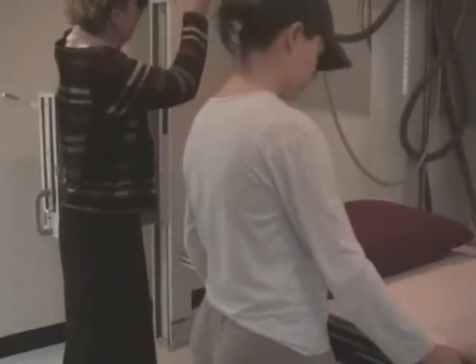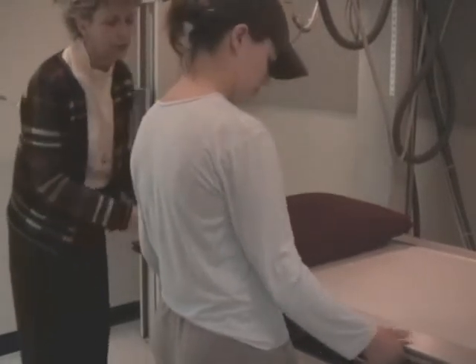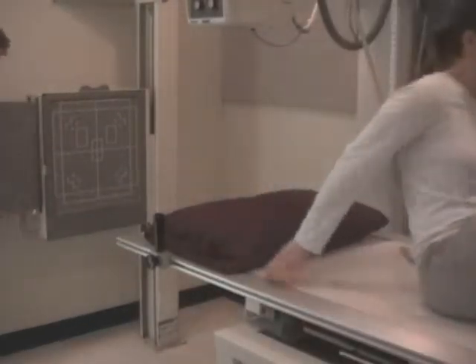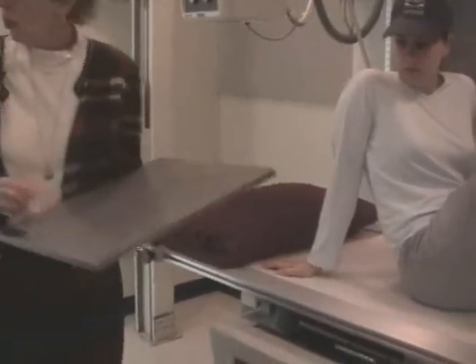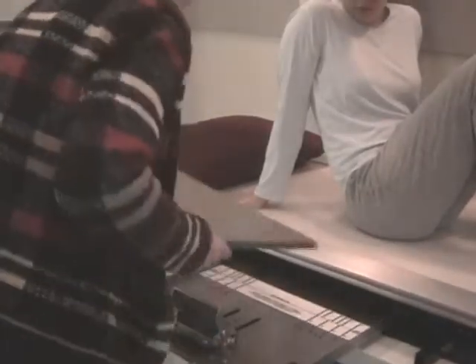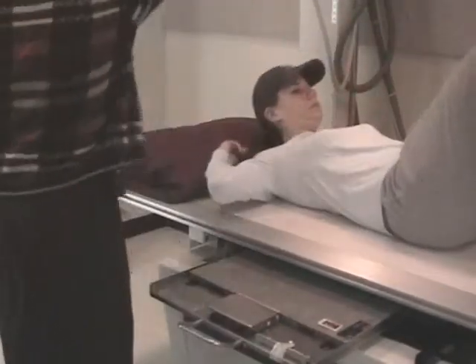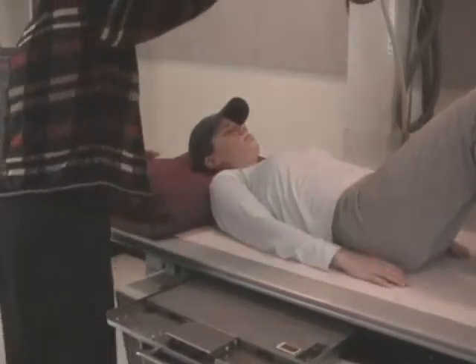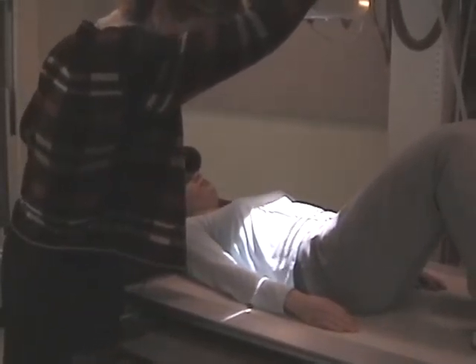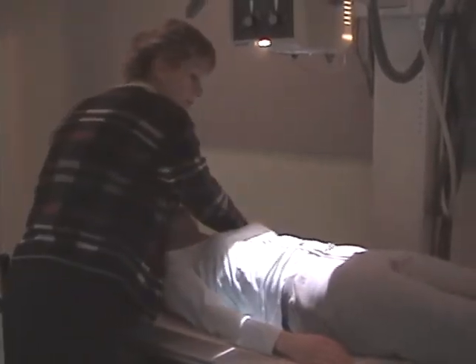You maintain the 40 inches of SID. Tube is transversely centered. You're going to utilize a 14 by 17 ID to the bottom. No marker other than the R or the L. Patient can lie flat on their back. Both arms down or both arms well above the abdomen. Patient's legs out straight. Get the patient straight on the table.